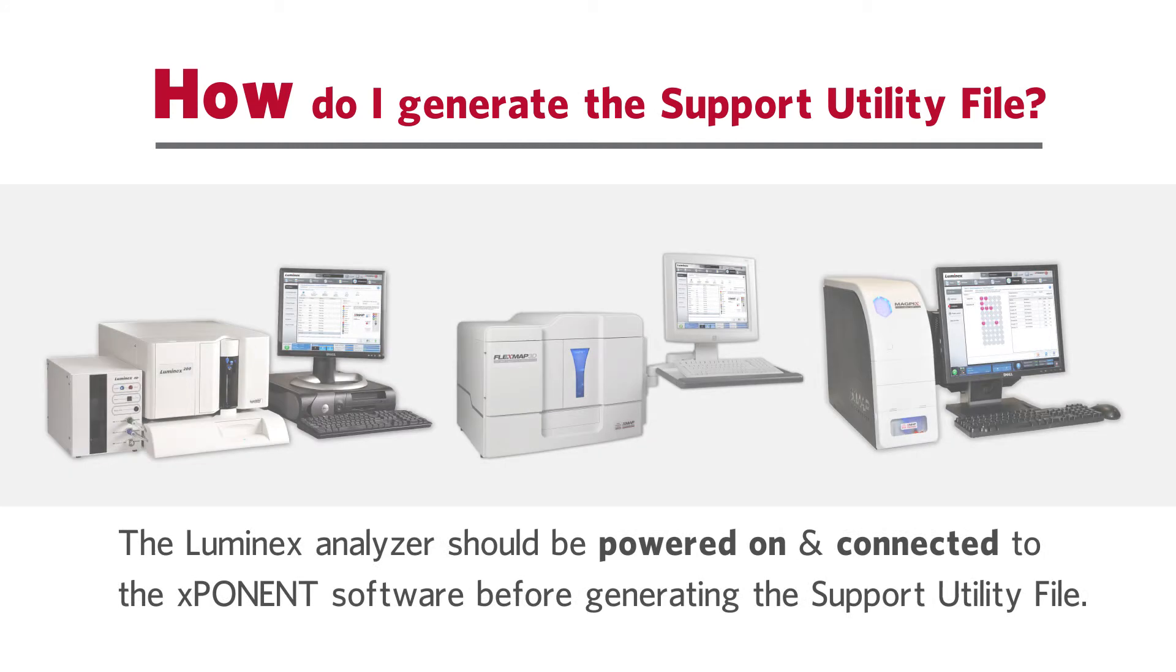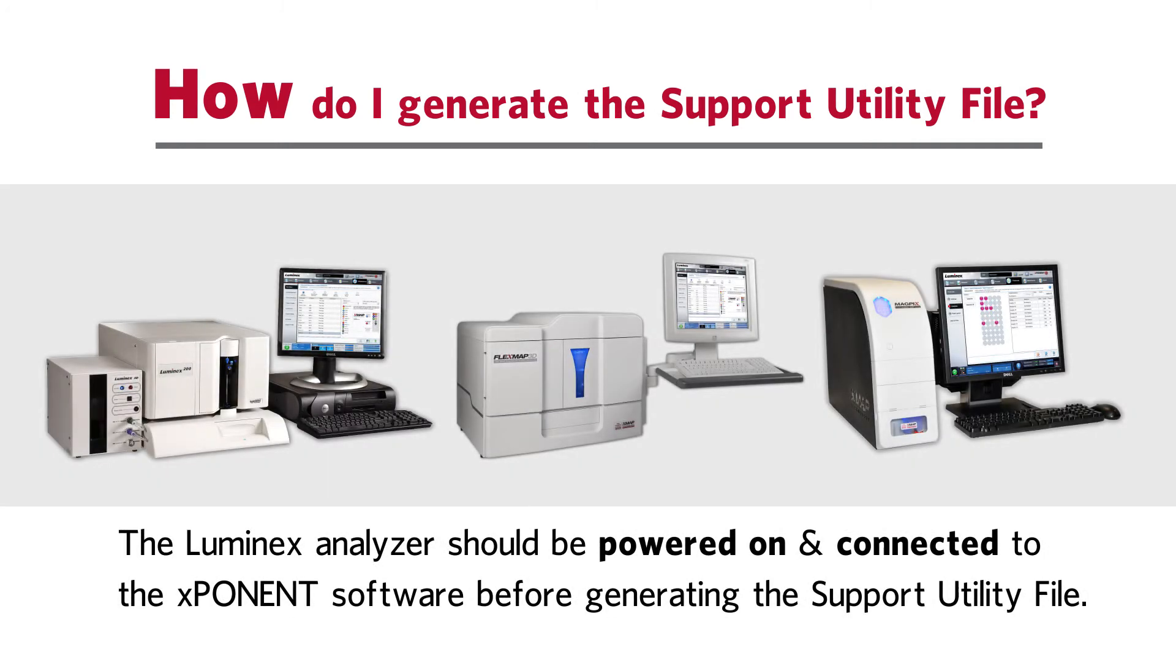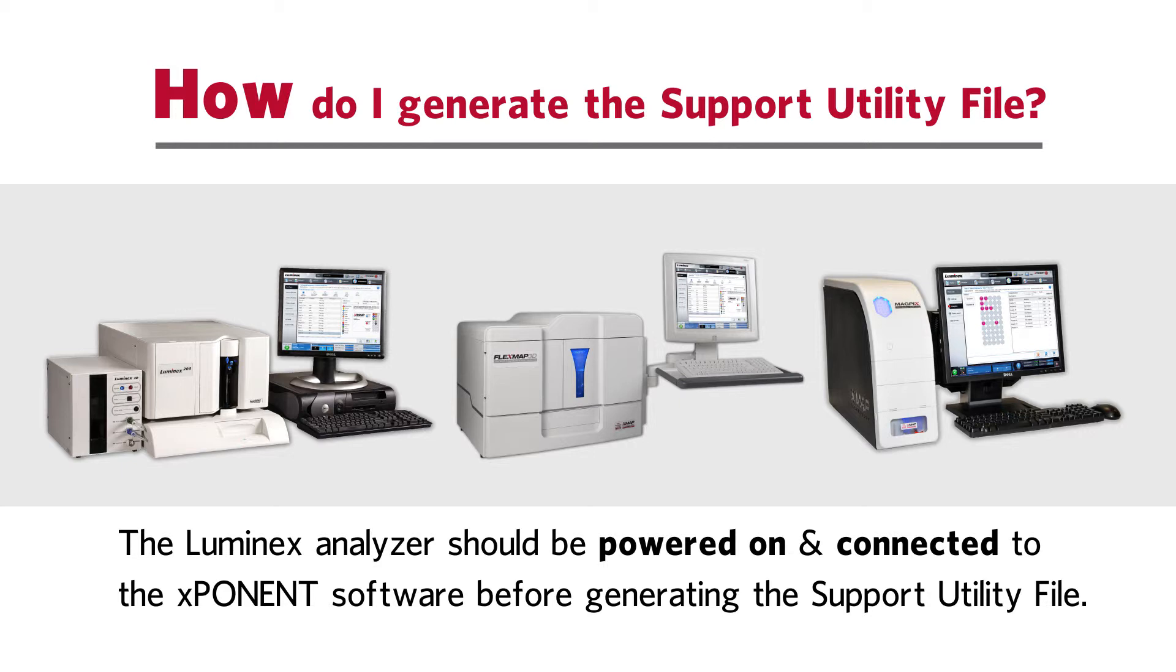Before we get started, it is important to note that the Luminex analyzer should be powered on and connected to the exponent software before generating the support utility file. If the analyzer is not powered on and not connected to the software, important instrument information will not be included in the support file.